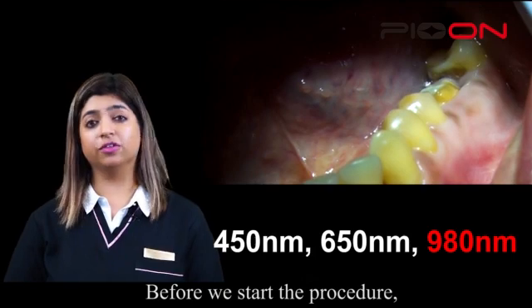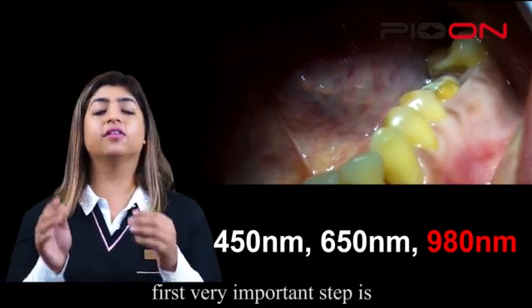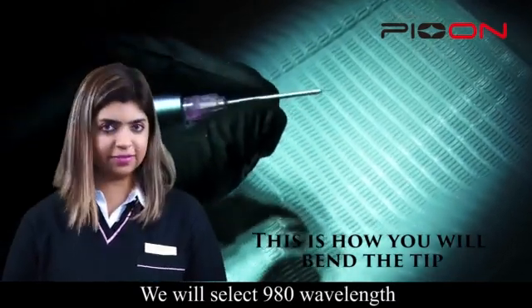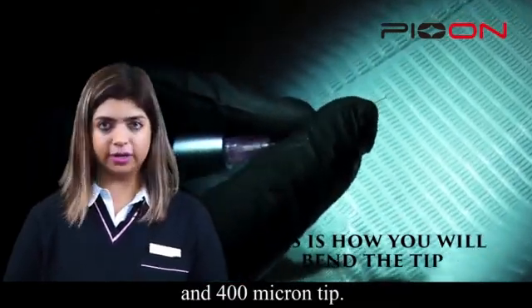Before we start the procedure, the first very important step is to measure the biological width by the bone sounding method. We will select the 980 wavelength and a 400 micron tip.